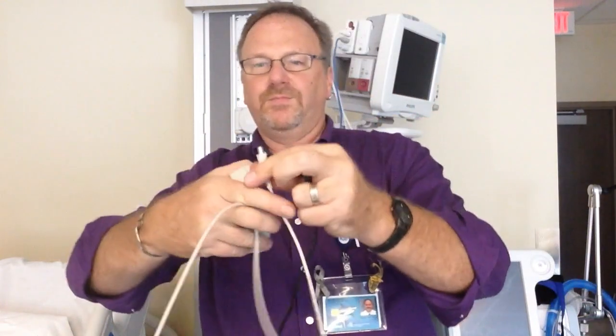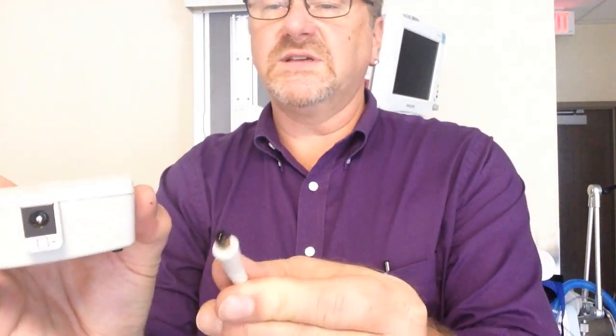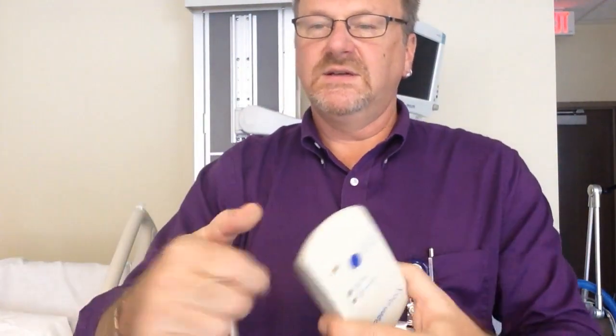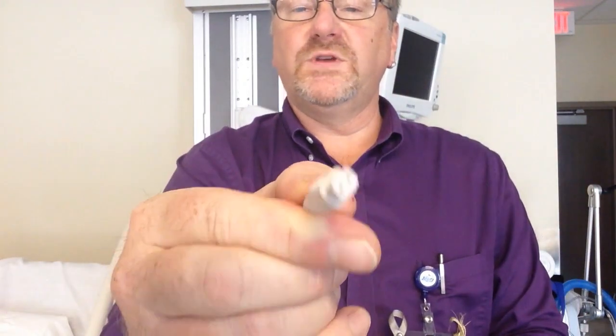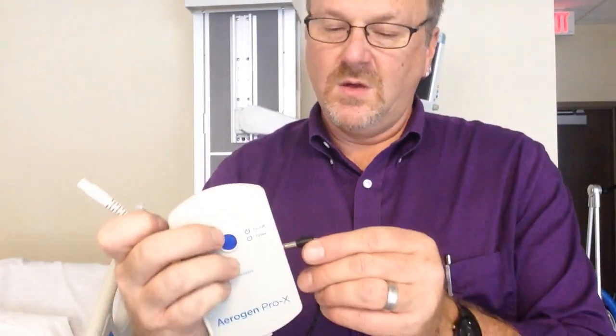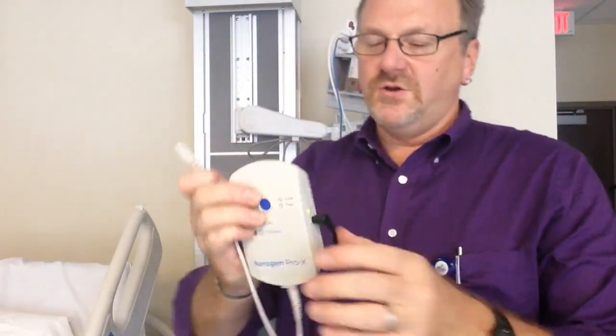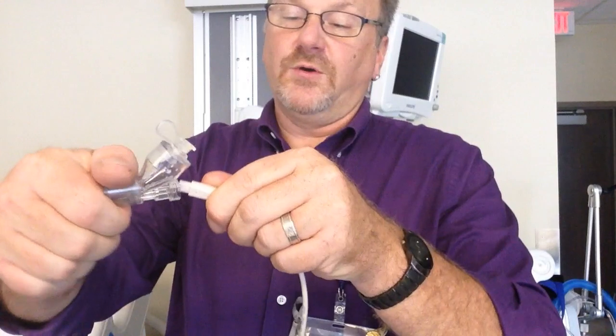This can be delivered via mouthpiece, or via mask, or however you want to do it. Going over the hardware first — we have our power cable, or interface cable, whatever you want to call it. It plugs into the bottom; you cannot cross-plug any of this. This piece right here will go to the Solo. Your power cord from the wall goes in the side, and when you plug it in the side, you'll see the green light is on, letting you know that it is charging. This end goes into our Solo, so be careful with it.